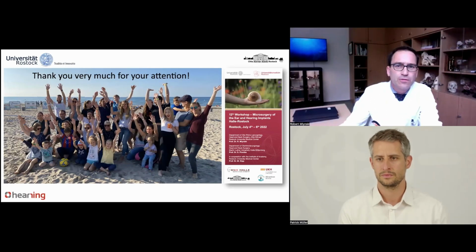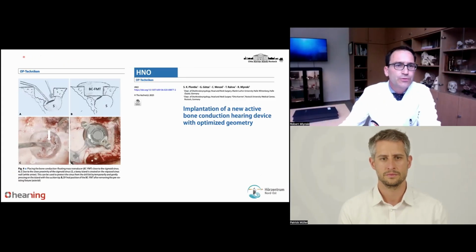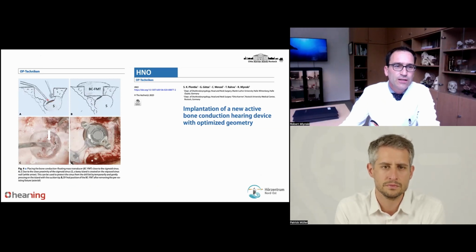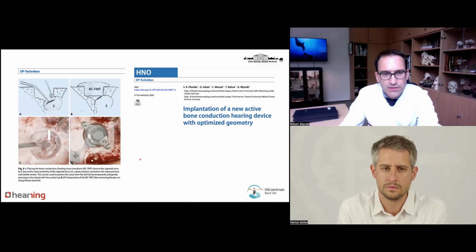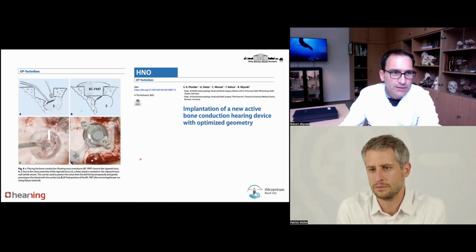So what we do is we leave a peninsula or an island on the dura, and we use the suction to compress the sinus or dura, and then we can take the drill to flatten the bed, and then when you lift up the suction again, everything gets back in place, and so that is the idea of it. Does that answer your question, Robert Wieck?